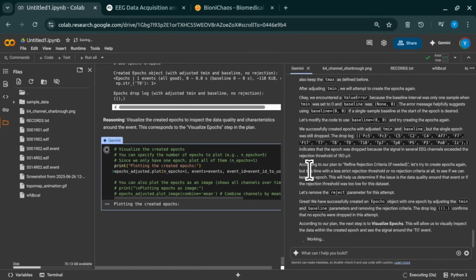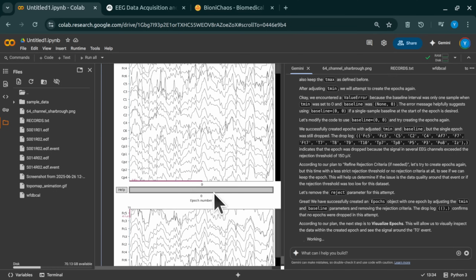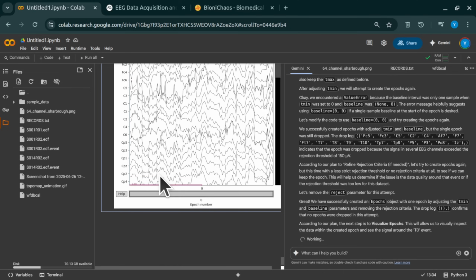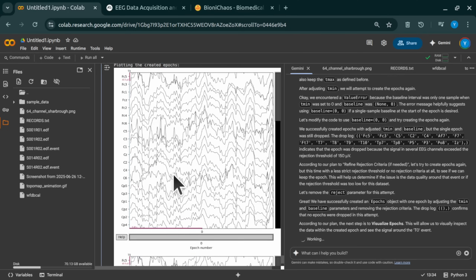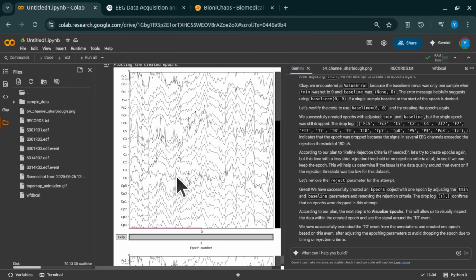Like a weather map for brain activity. That's a pretty good analogy. It takes the data from each of the 64 individual electrodes and cleverly interpolates or estimates the activity in the spaces between the electrodes. This gives you a smooth, color-coded map across the whole head.